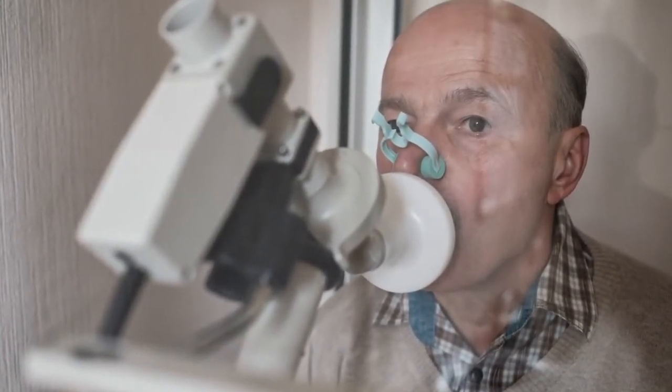So today I'm going to talk about lung function testing and mainly concentrate on spirometry. We'll talk a little bit about gas transfer as well and where that fits in. But spirometry is a really useful test, and it can be done in most general practices, and so is very helpful in the assessment of patients with respiratory problems.